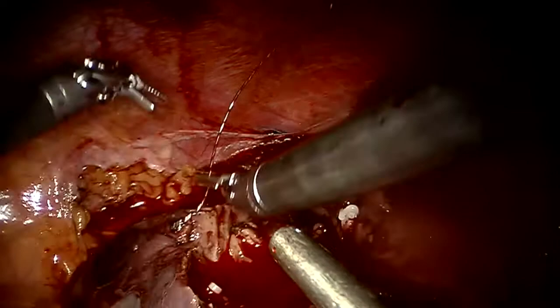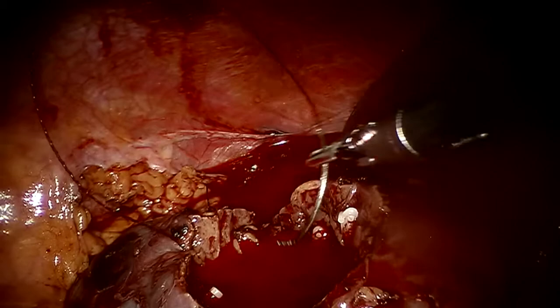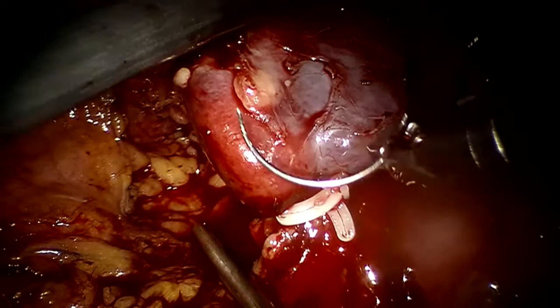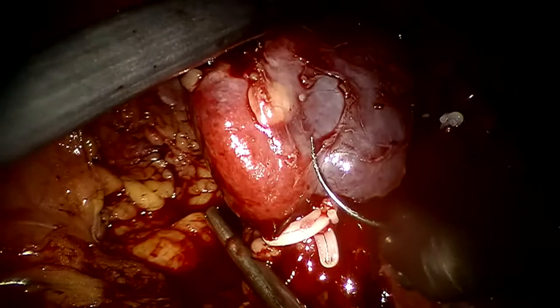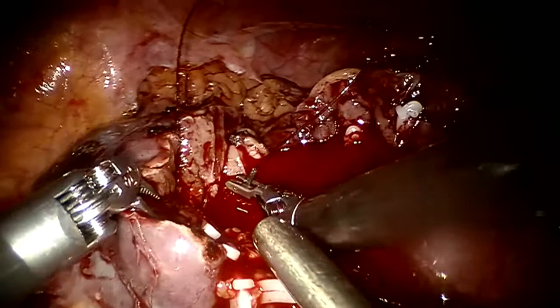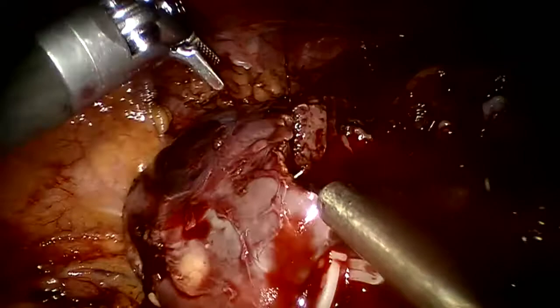So the lower pole is not looking too happy. See that? That's not looking too happy at all. Although the front is looking fine, the line of demarcation is right there. You see that? Tullio, Vincenzo, what do you say, guys? That's the line of demarcation. So a little bit of collateral damage. You know, some innocent civilians are going to die, obviously. Hanging out in the wrong neighborhood is not a good idea. Some innocents are going to take a hit.